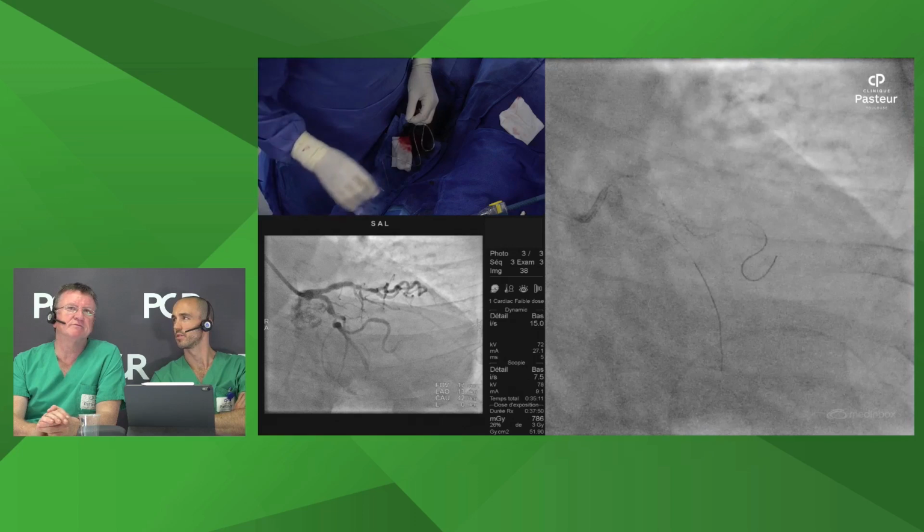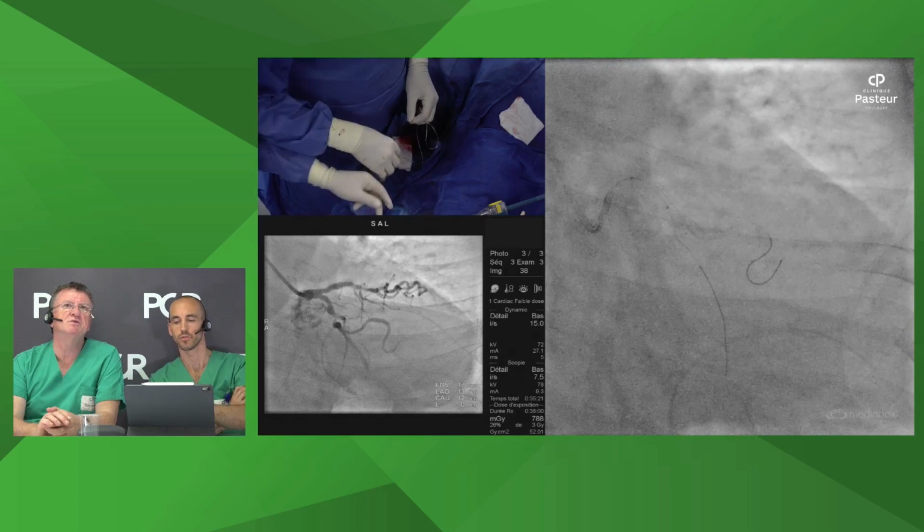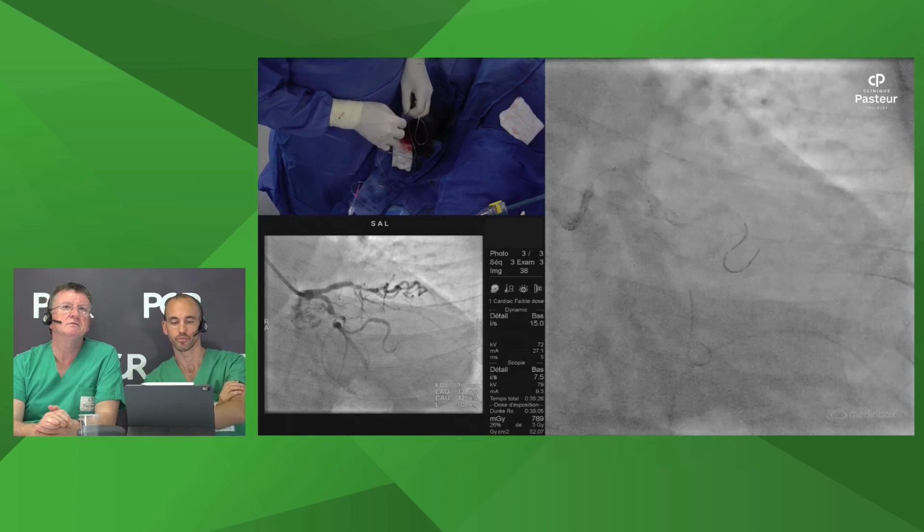Do you use something? I've never done that. No. I mean, it may help you in the proximal segment there to determine precisely where that wire is. Yeah, of course. But I just don't think an IVUS is going to be deliverable. Here is better. It's better, but the balloon, now we have just the difficulty to cross the struts.